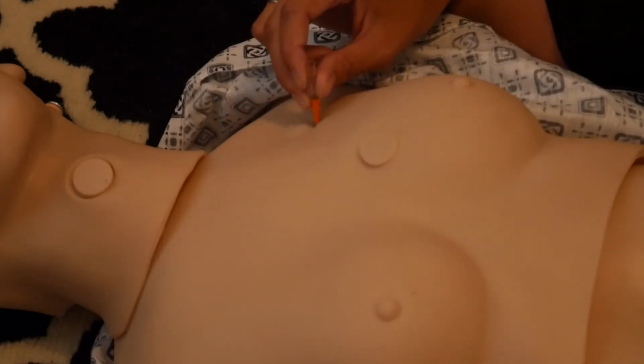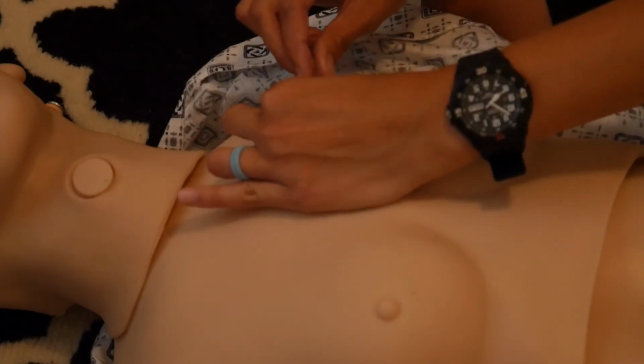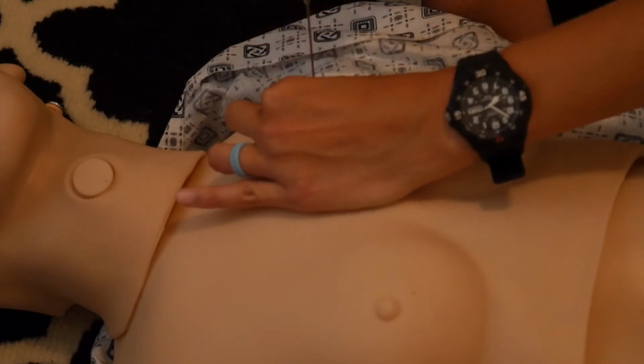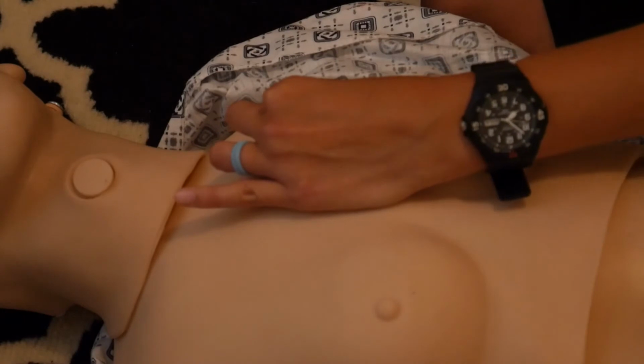So 5 to 10 seconds is up. You want to remove the needle and leave the catheter in place. Put this somewhere safe.